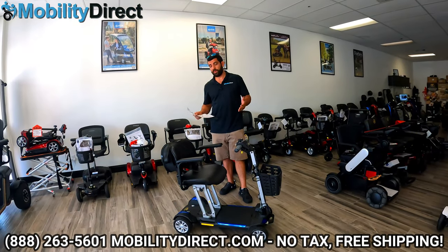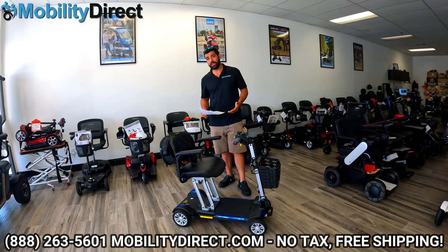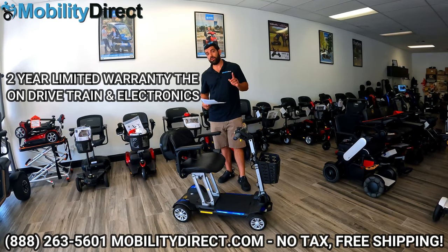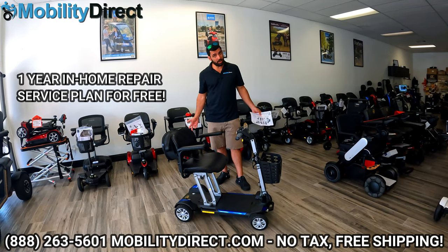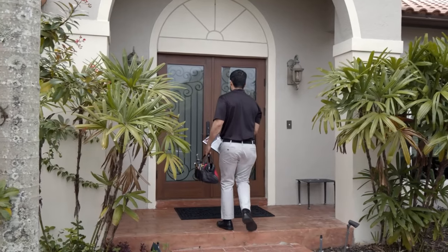Something else that's really awesome about this model is the brand behind it. It comes with an industry-leading warranty, which includes a lifetime limited warranty on the frame, two years on the electronics and the drivetrain, and one year on the battery. You also get a one-year in-home repair contract free of charge. That's how confident Golden Technologies is in this product — they're willing to include one year of in-home repair coverage.